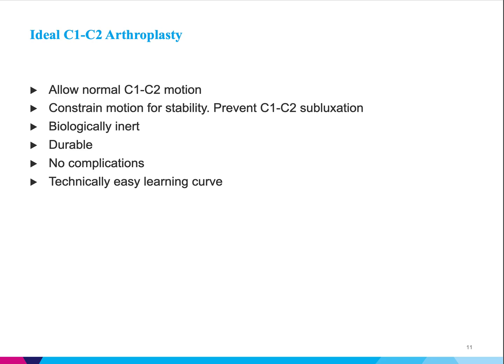Of course, we would like our implants to be biologically inert. They have to be durable. If you put an implant into a patient, it should ideally last the lifetime of the patient. And of course, since we're talking about ideal scenarios, there would be no complications related to the arthroplasty, and it would have a technically easy learning curve. So the technique would have to be relatively familiar to surgeons for early and widespread adoption.